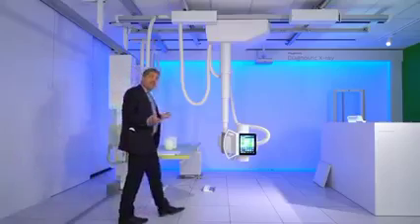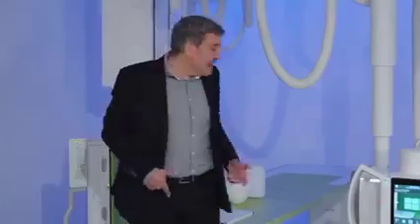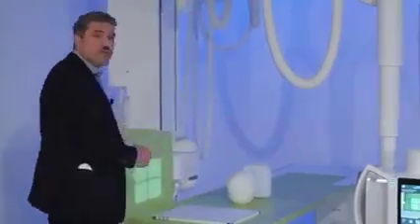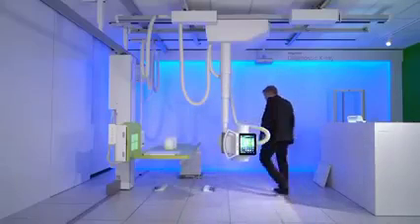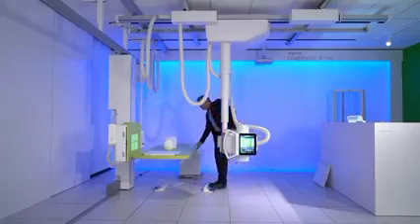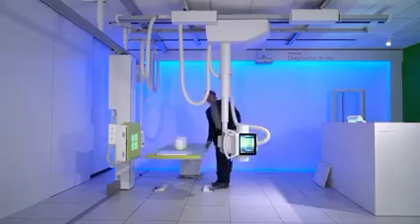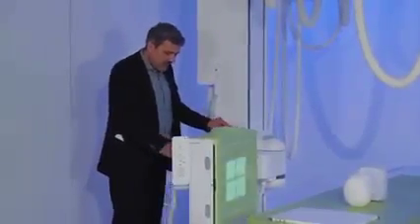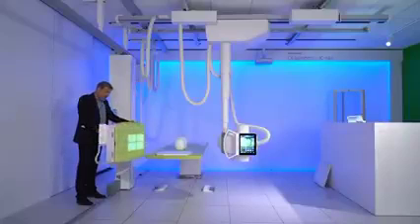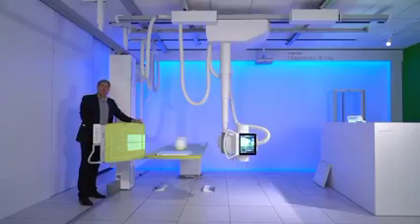Another projection that is needed is, of course, if you have a hip fracture. Then this exact perpendicular view is not helping you, because you need to do this at a certain angle. Also, this is possible with this movable wall stand, because you can not only make the exposures like this, but here the system itself can move and angulate in different directions.